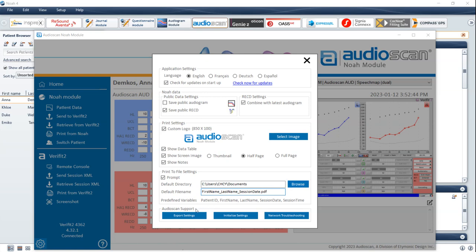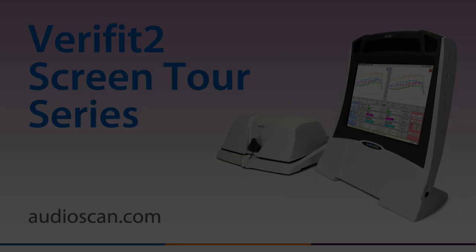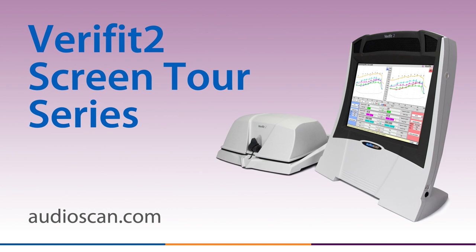The AudioScan support section of the settings menu has options to facilitate troubleshooting. Export settings saves a log and the current settings for troubleshooting purposes. Initialize settings resets the AudioScan NOAA module to its default settings configuration, and network troubleshooting can be used to evaluate network communication issues between the AudioScan equipment and the PC. For more information, please see the AudioScan NOAA module user guide.